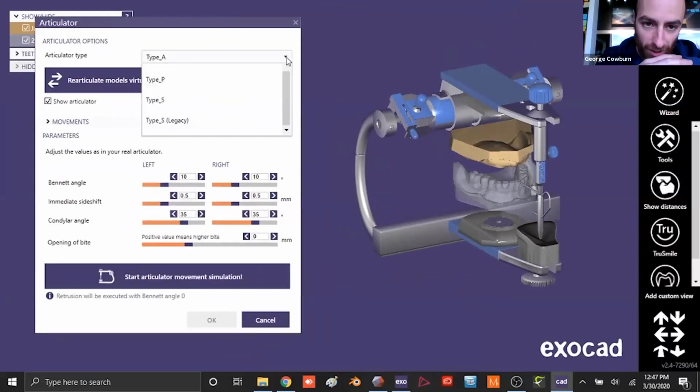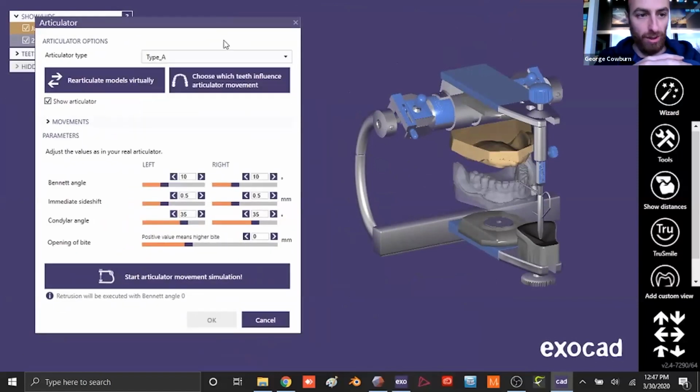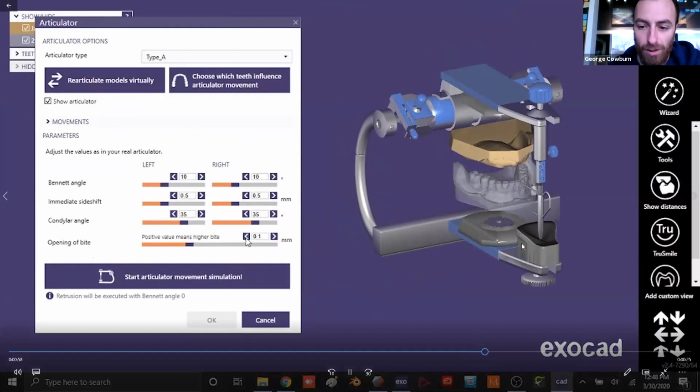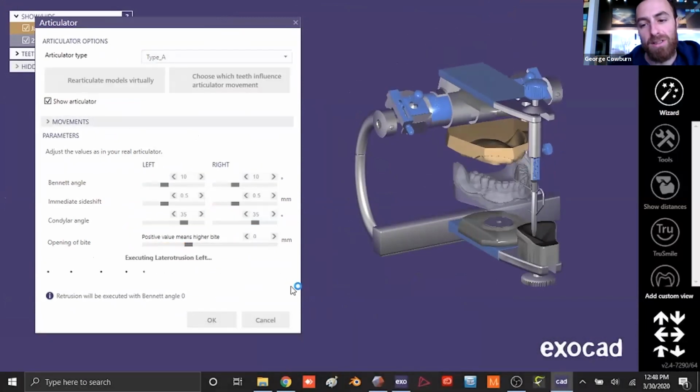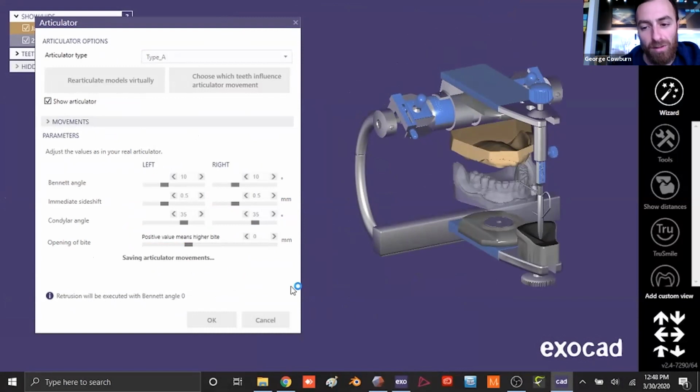And if you have a face bow transfer, this is where you can have a more accurate input, so that we can get a face bow and be able to input this. Usually it's inputted from your scanner. So they'll either have a magnetic transfer plate like they have down here at the bottom, or you can actually put your whole physical articulator into the scanner, like some scanners permit. So from that, you're able to transmit some of your facebow information.